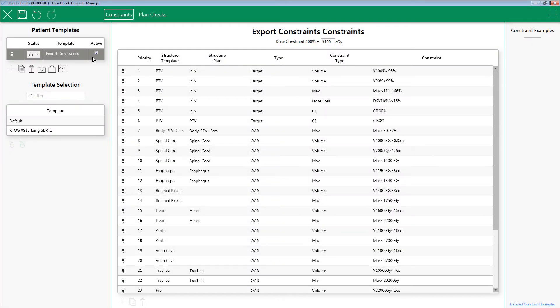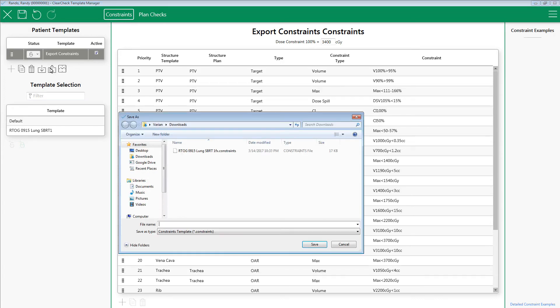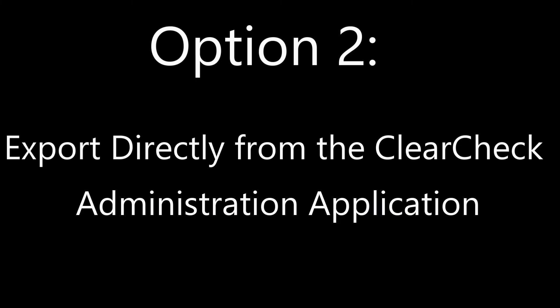Option 1 is using the Patient Template Manager. Once you are in the Patient Template Manager, highlight the constraint templates you would like to export. Next, click the Export icon located here. Now just save the constraint template to a location on your hard drive.